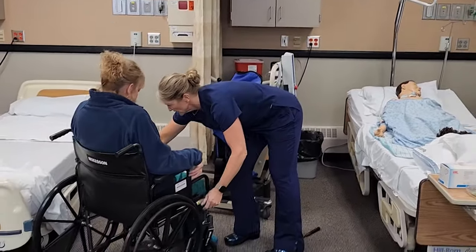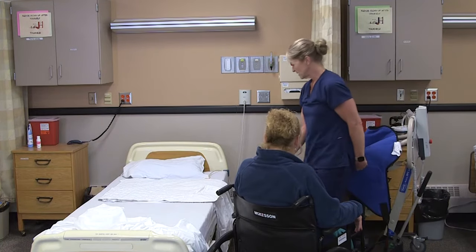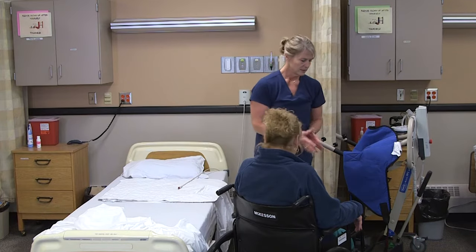Let's get your brakes off your wheelchair. Is there anything else I can do for you? I'm going to make up your bed and give you your call light. Make sure this is locked. And wash my hands.